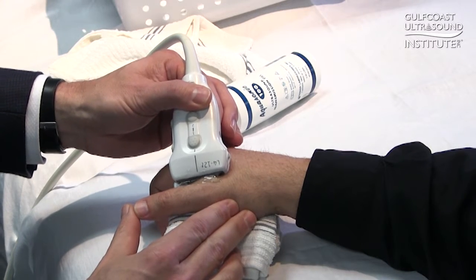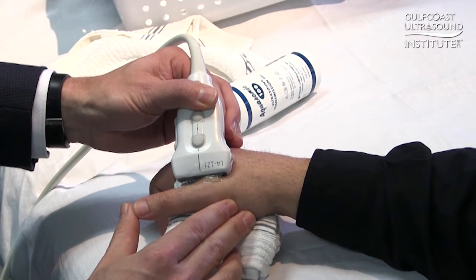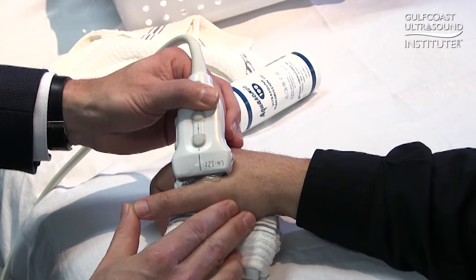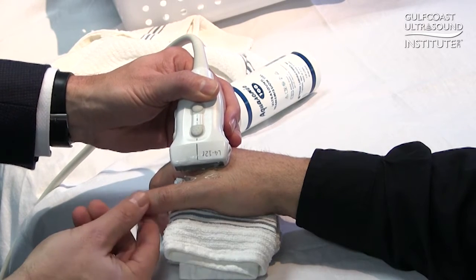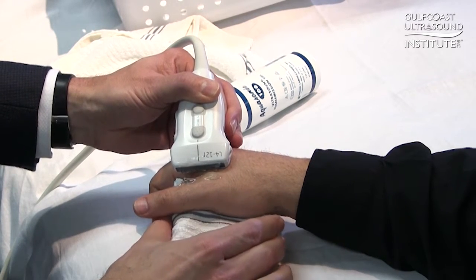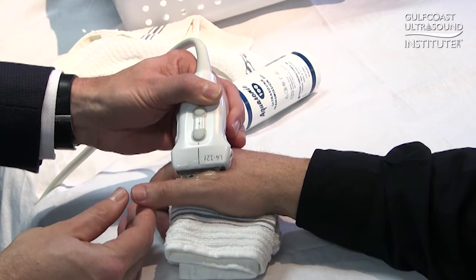There are a couple of key points in evaluating the thumb looking at the ulnar collateral ligament. The first is placing the probe in the coronal plane relative to the thumb. Note that the thumb is placed overhanging the edge of this rolled up towel, which will allow me to place the transducer directly in the coronal plane.